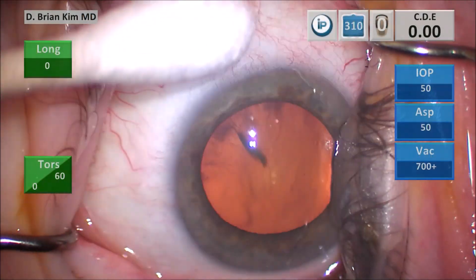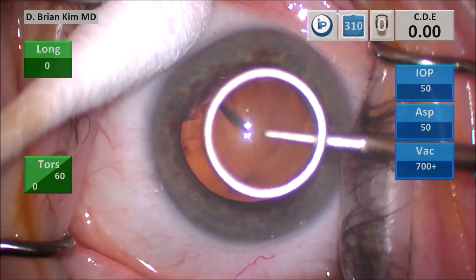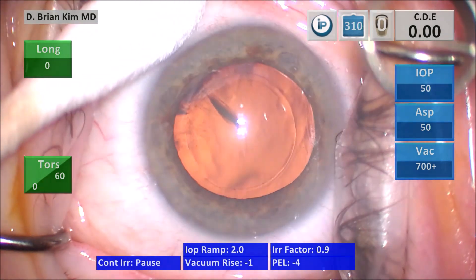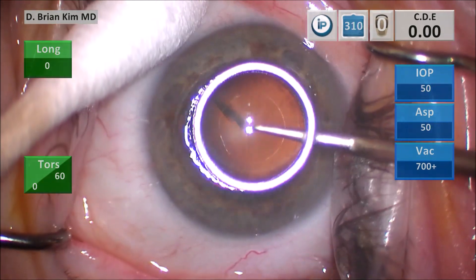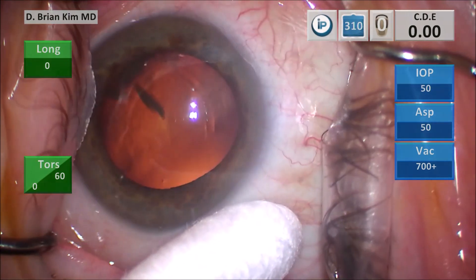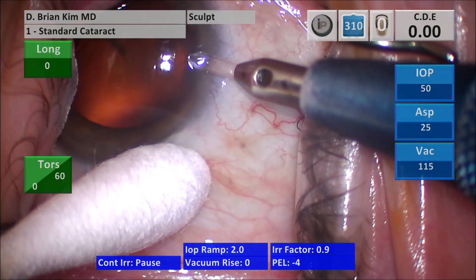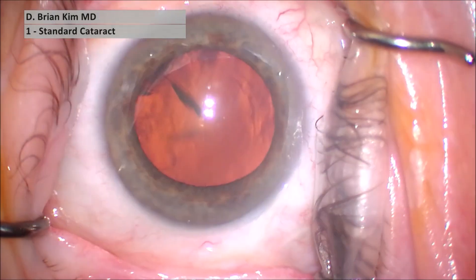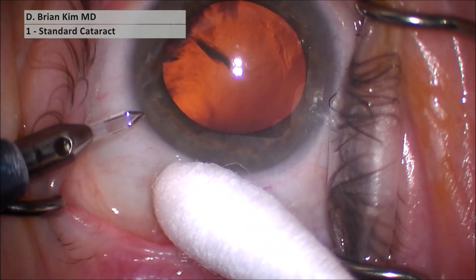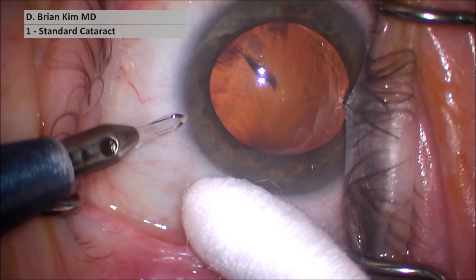You can see this patient — this is a left eye. The patient's really having a hard time. He's looking up, which is towards the right side of the screen. I'm using a cotton tip to help manipulate the eye downward. I'm using a corneal marker, which will help me center and size my rexus. I'm asking the patient to look down. Because I don't trust him, I'm using the cotton tip to support the eye as he looks down. Then I make my paracentesis incision, which is flat to the iris plane. I'm doing the same thing on the other side. You can see how this patient's got these quick jerking movements — this is pretty standard for a patient with a very strong Bell's reflex.